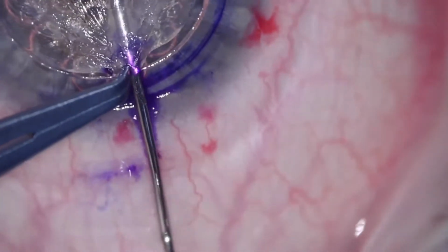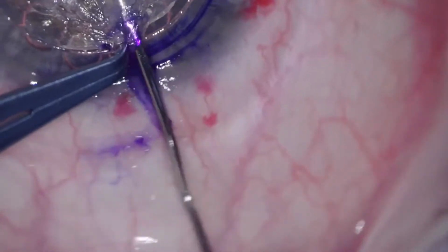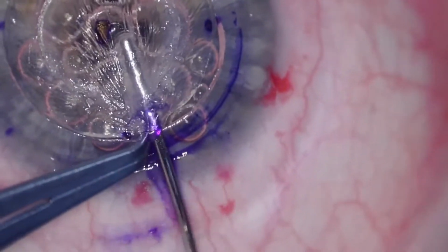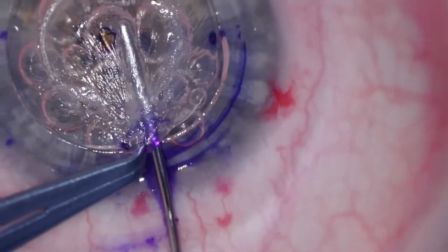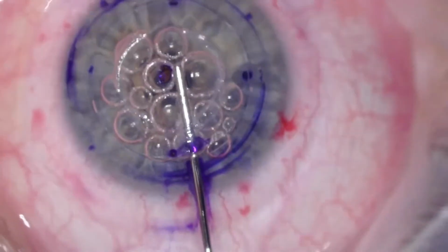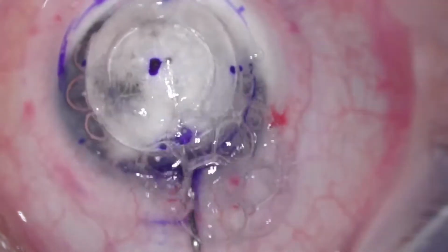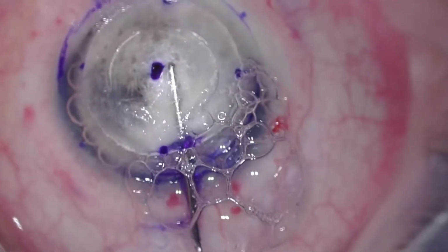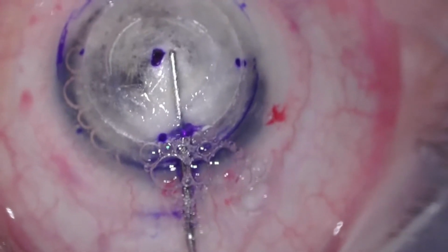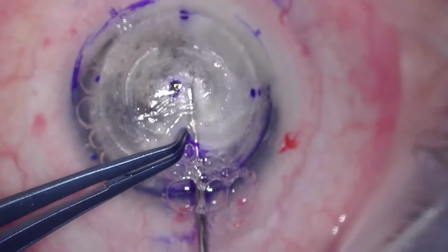Here I'm using the DALK cannula attached to a 5ml syringe of air and wiggling it from the posterior edge. That wiggle or shake that I'm doing helps open up the posterior stromal fibers. You can see it's almost gliding through. There shouldn't be too much resistance. I'm going beyond the center point, and now I'm going to inject. You can see the gentle injection, and now you can see the big bubble develop. That ring of white that develops tells you that you've successfully achieved a big bubble. Here you can see the regurgitation of the air.